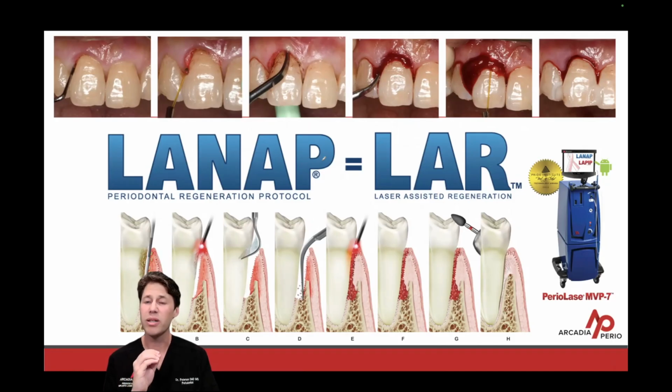In terms of osseous regeneration, radiographically, we know about 80% of the wound healing in terms of changes radiographically will happen within the first year. Within year two, about 15%. And year three is the additional 5%. So with one laser treatment, bone will continue to improve and densify for up to 3 years, as long as we account for the etiology and the occlusal trauma and the pathogenic bacteria. So you'll see in this case how bone continues to improve over time.